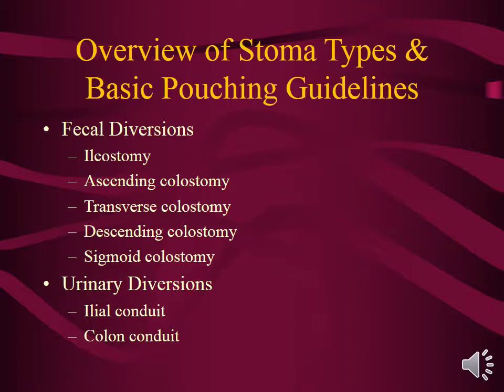Moving down to the sigmoid colostomy, that is the only ostomy that patients should be irrigating, and they can be taught to irrigate once a day for what is considered continence, even though they really aren't continent because they don't have any feelings there, but they can use a sleeve and irrigate and have a bowel movement in the toilet once a day, and then they can use like a cap or a little one-piece block pouch just to cover that stoma up.